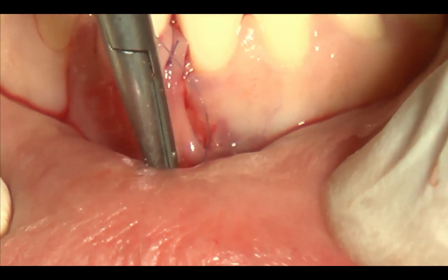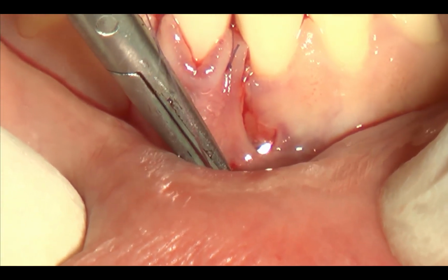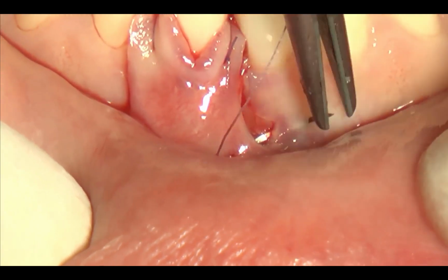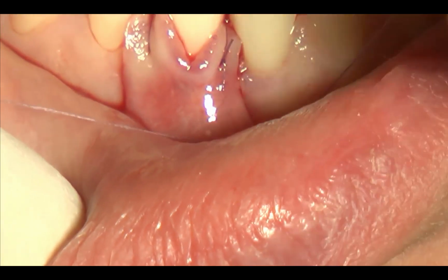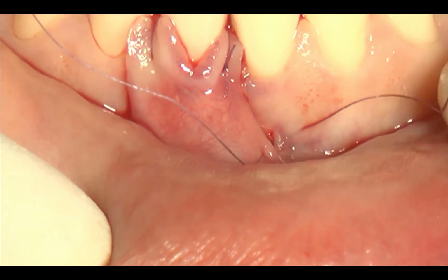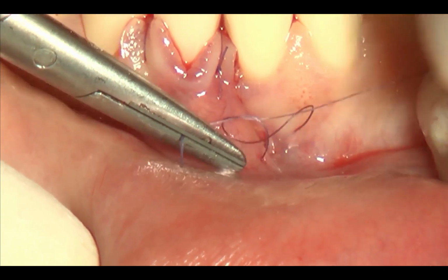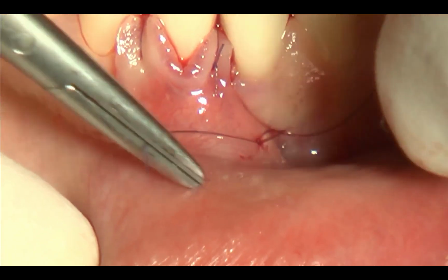So we take the alveolar mucosa, periosteum, adjacent soft tissue. And now it's very important to fix this knot in apical direction.